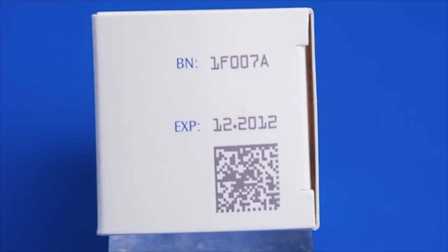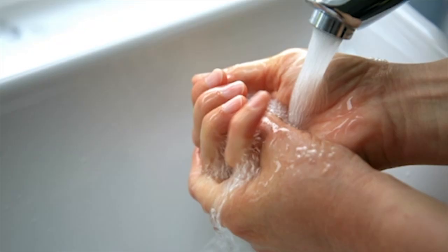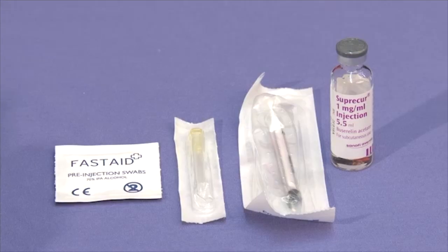Check the expiry date on the pack and do not use the product if it has expired. To give a single injection, first wash your hands and find a clean place to set out the items you need.